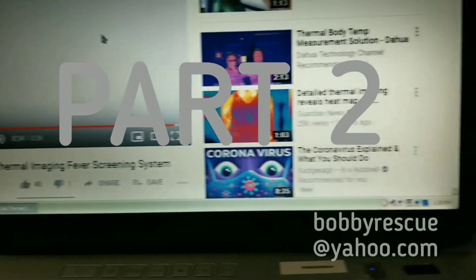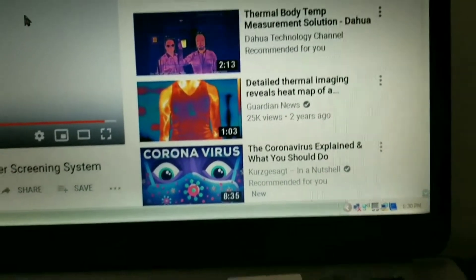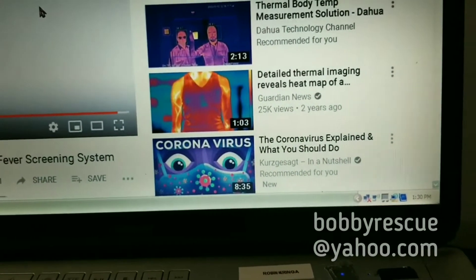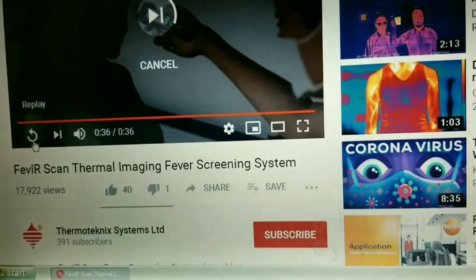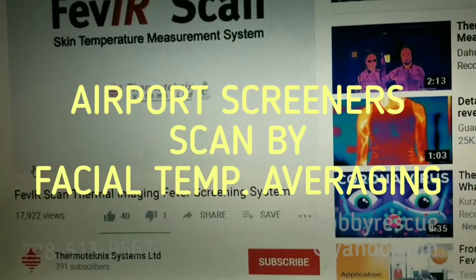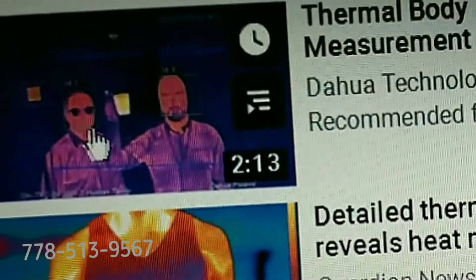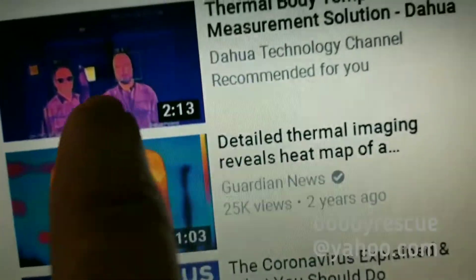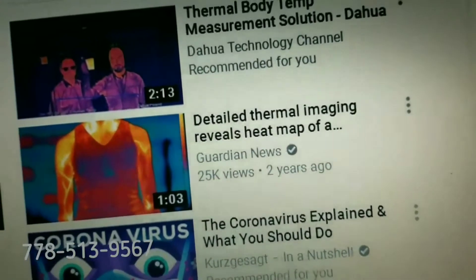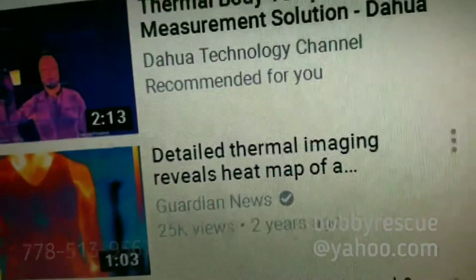These are the different types of systems that really don't work but give the public a false impression that they're doing something. These systems use an averaging method — they average the whole face. Here's a really clear example: you can see how it's taking the temperature of a guy with glasses. Someone with glasses — you cannot see their tear duct temperature. These systems all just average the face.